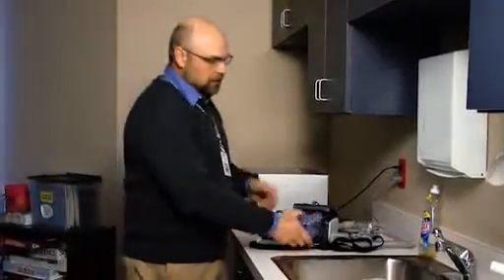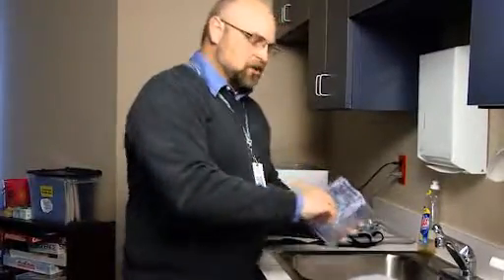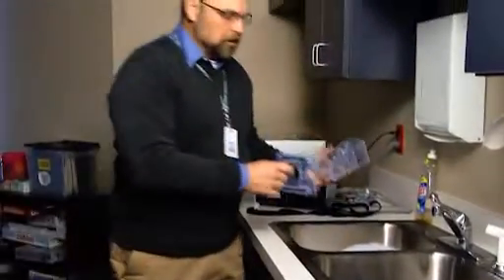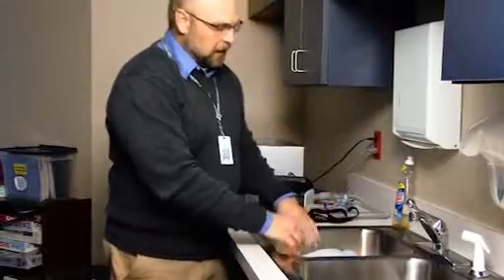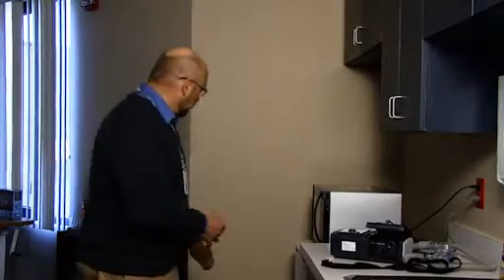You want to just lift the lid, pull it out. Whatever water's in there, you just want to dump that out, and put it in the sink, soapy water, and just slosh it around and let it sit there. You want to wash it on a weekly basis, just because you don't want bacteria to grow, and you don't want to have a swamp with that water sitting in there, and it gets kind of funky in there.